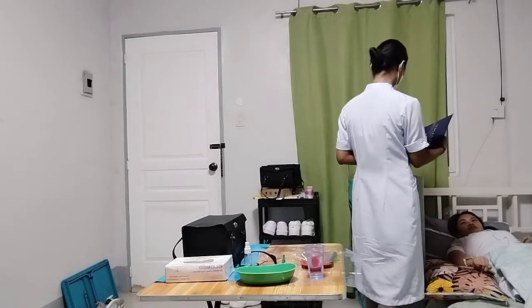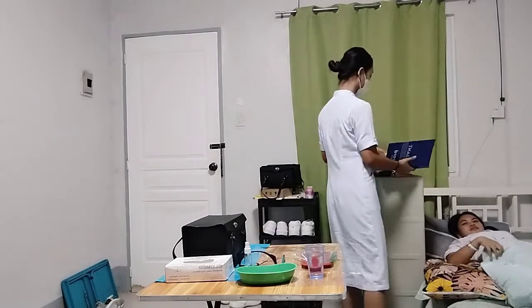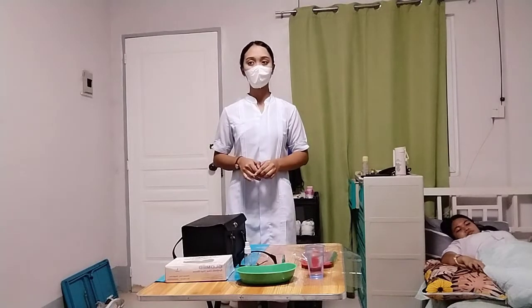So, naiintindihan niyo po ba? Yes. So, pwede na po tayo mag-proceed. Thank you po. So, we need to perform hand hygiene and observe appropriate infection control procedures.